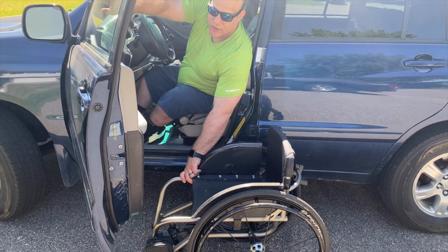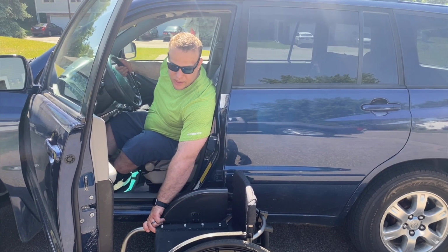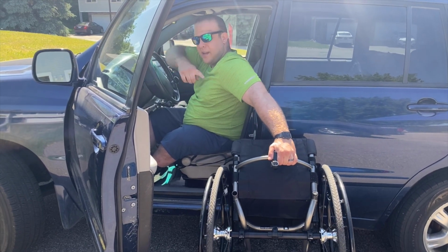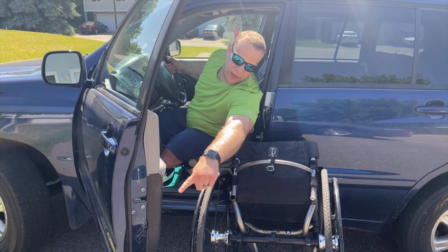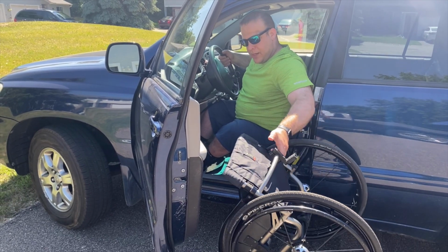So to make sure the door is all the way open, and this is where my process has changed a little bit. I used to either tip it up and face my chair like this, and that obviously you can see used to kind of scratch my paint up and dent. And also there too. But now what I do is I put it in.